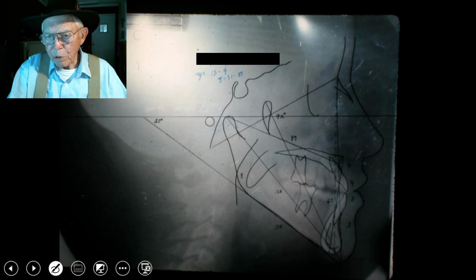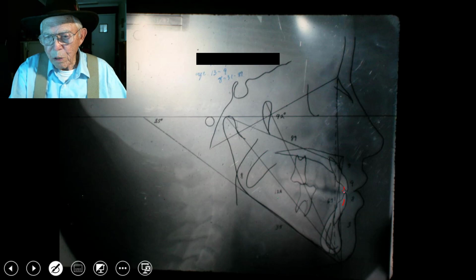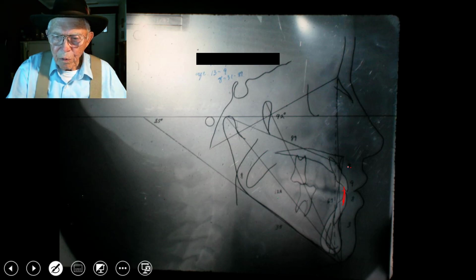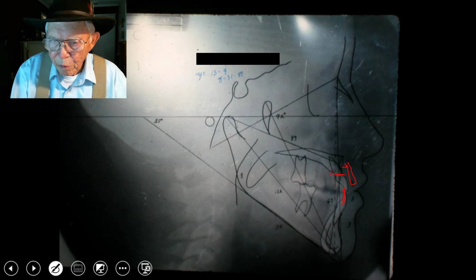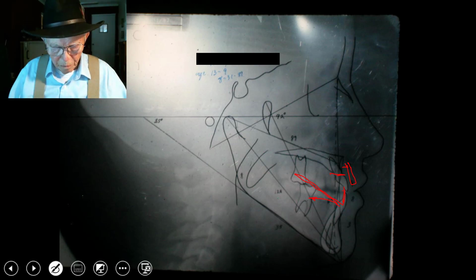And the way we took the cephalometric picture here, she's closing almost exactly end to end right here. I did not use a lip bumper in her case, but I would use a lip bumper and run interference for these teeth. And then we're going to come in here and pull elastic on this. And then we'll also have this coming back with elastic here on the bottom too. And so we correct both upper and lower jaw at the same time, doing the case like this.